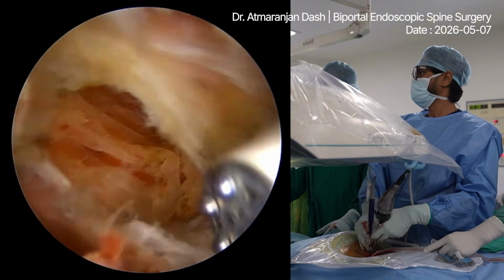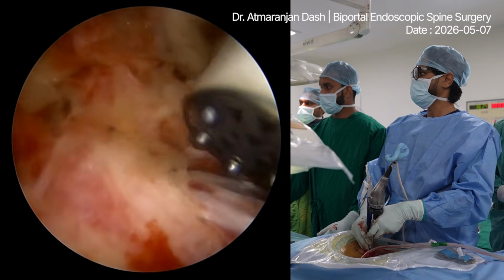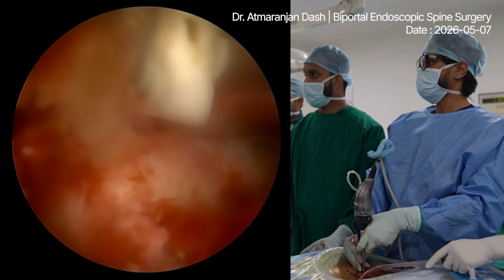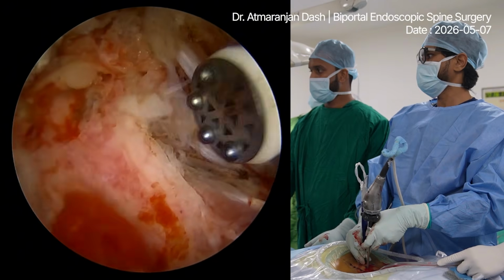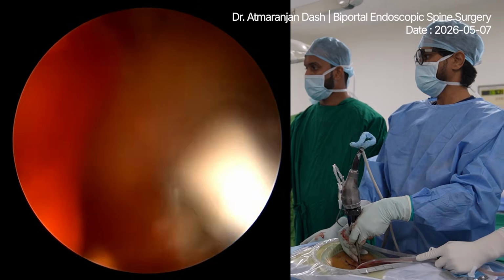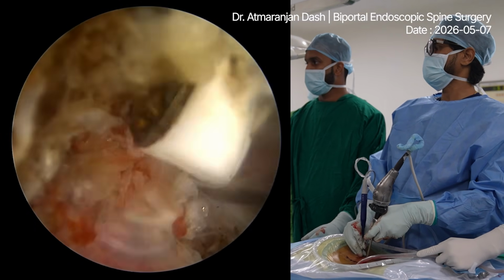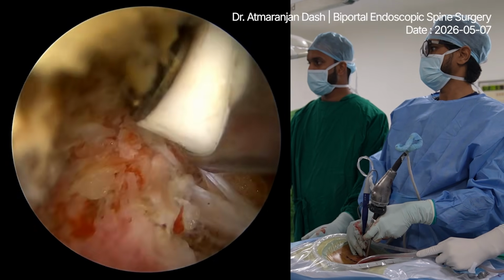Stop. The TP is broken or what? Looks like the TP is broken. Ablate. Sometimes the TPs are broken. Stop. It's a broken TP, you see, maybe from the previous coagulation. And you see the scar tissues and everything, which is quite common. Ablate. But you should understand the foramen is here. Stop. Ablate.